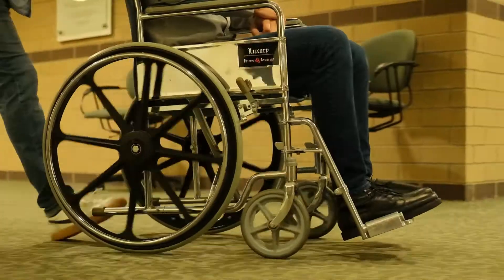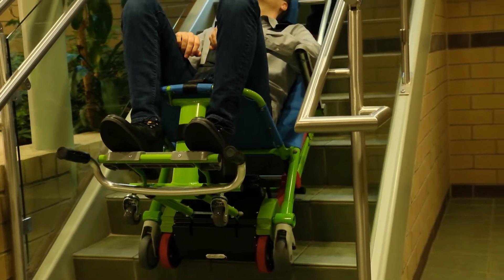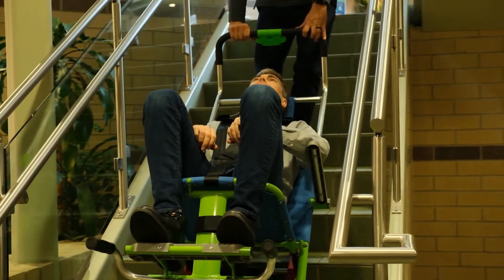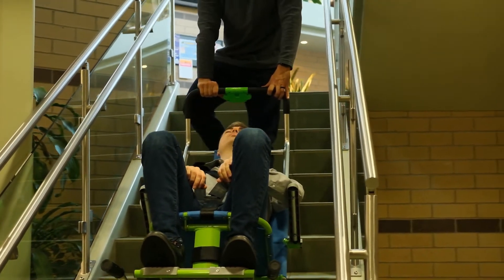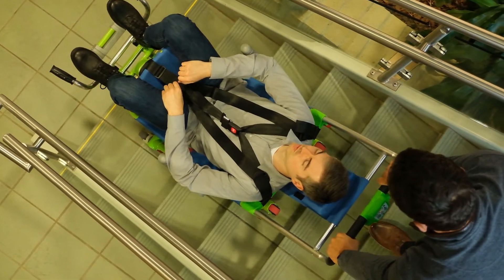EvacuSafe's tracked evacuation stair chairs are designed to enable the safe and comfortable evacuation of mobility impaired people in the event of an emergency such as a fire. The XLE powered chair is EvacuSafe's motorized evacuation stair chair that allows a vulnerable person to be evacuated up and/or down a flight of stairs.